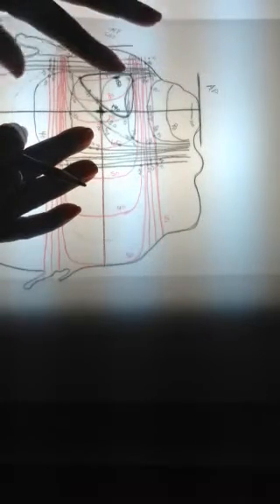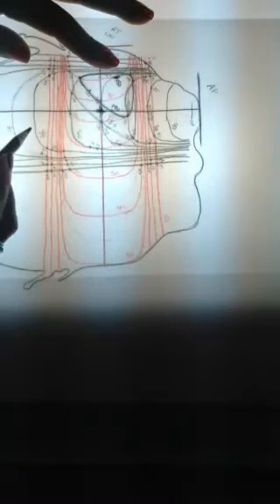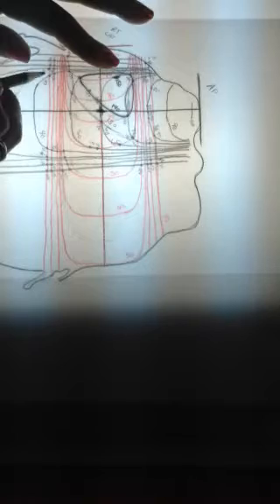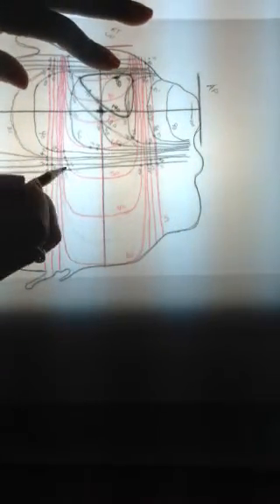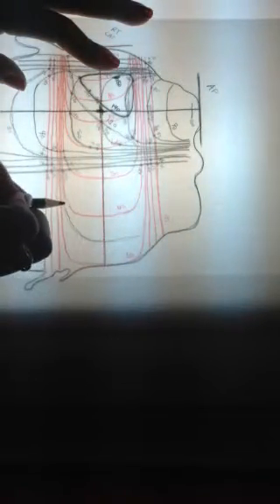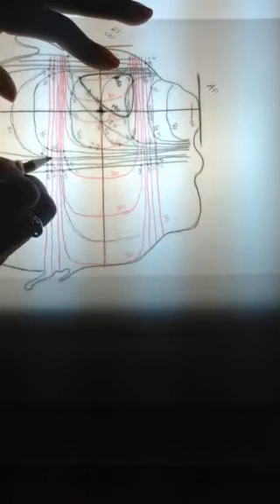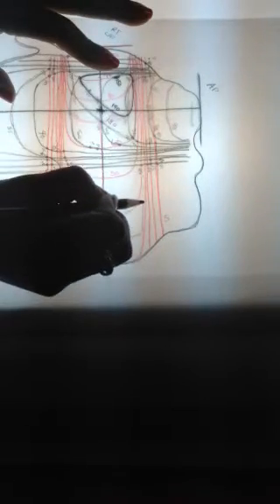Match up our central axes. Right now I'm going to see if I can connect the 35% isodose lines. There's a 35 right there. This is 35, and this 35 does not cross over into any of the dose lines from the red. So this 35 goes this way. There's another 35 there. Here's 35 out here. And there's 35 here. And this 35 likely connects here until we get to some point in there.